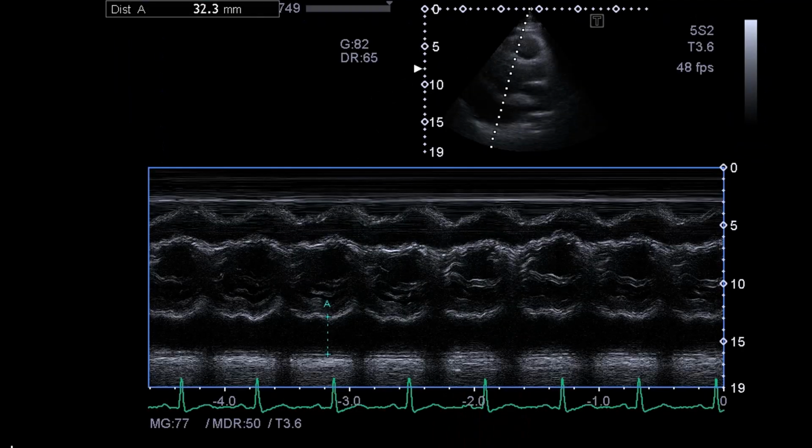Let's look at the left ventricle more quantitatively. What kind of image is this? Of course, an M-mode. The M-mode is placed through the septum and the posterior wall, and in the middle here, that is, of course, the LV cavity. This corresponds to the septum, the cavity, and the posterior wall here. And here, at the top, you can see the RVOT area.